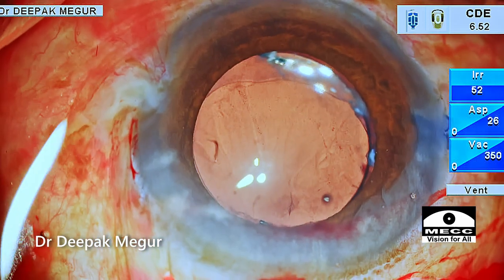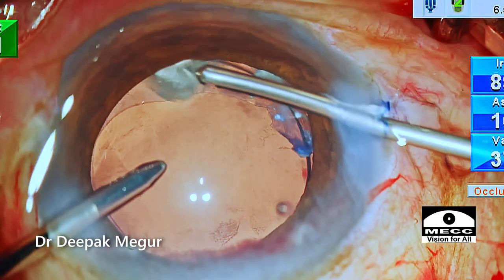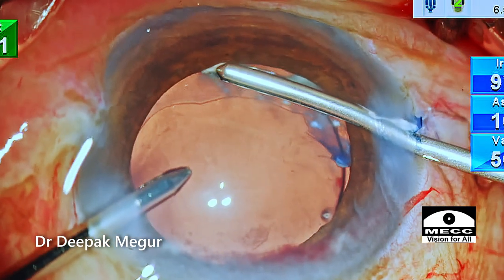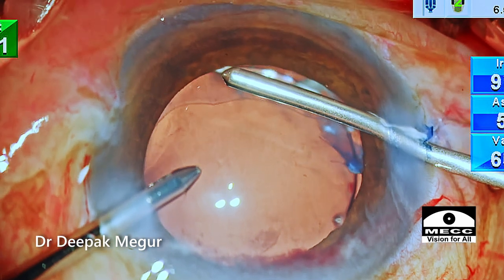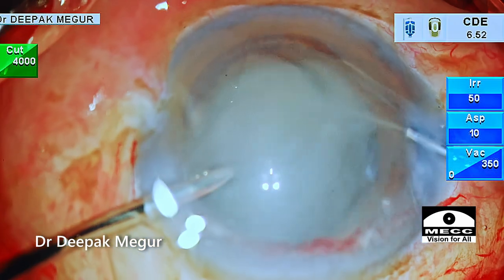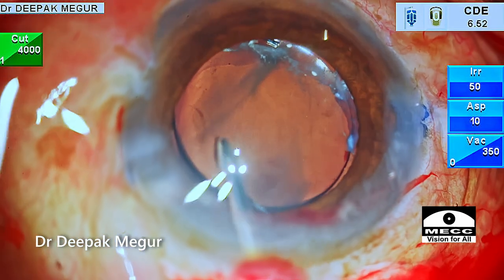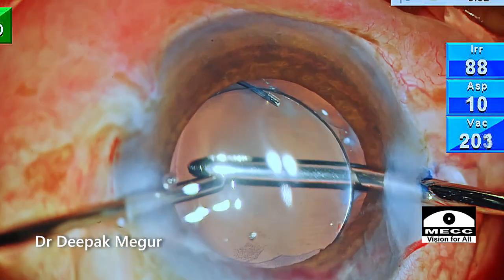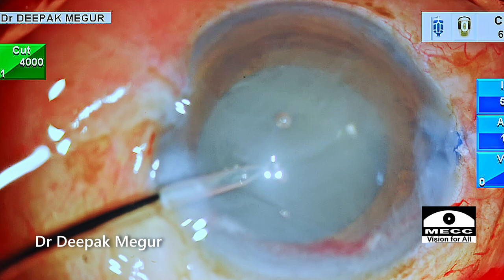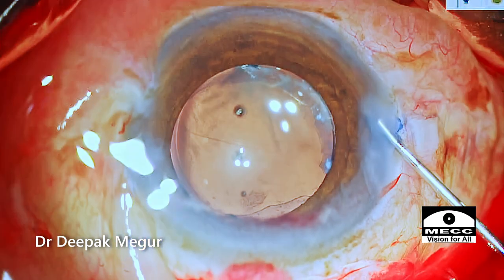Once the lens is in place, I'm putting in triamcinolone acetonide to rule out any presence of vitreous which could have migrated across the weak zonules. There seems to be just a little bit there, so I'm doing some anterior vitrectomy. We can clearly see that the triamcinolone acetonide has migrated across the zonules into the Berger's space — it will remain there, no problem at all. I recheck for any prolapsed vitreous one final time — there is none.